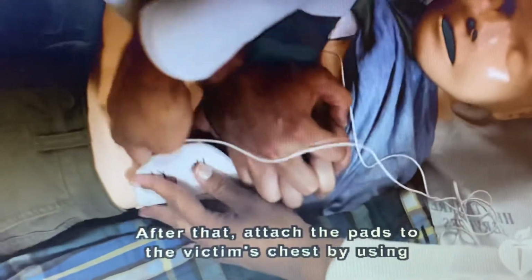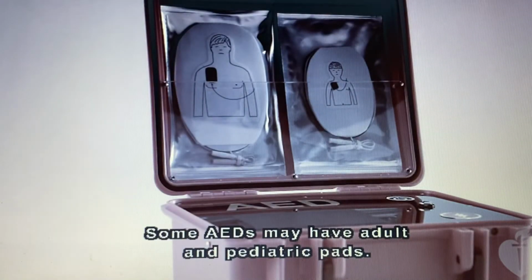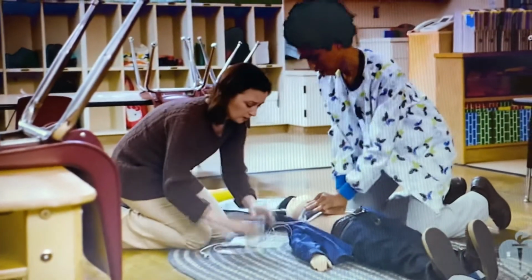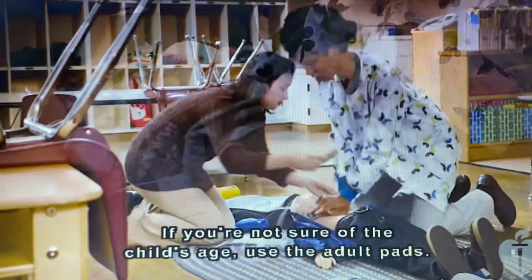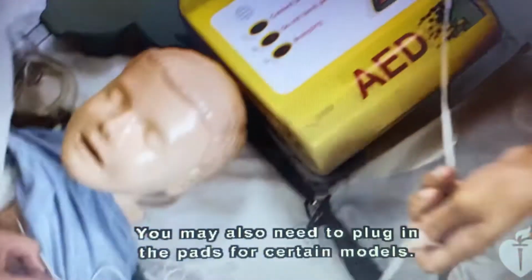After that, attach the pads to the victim's chest by using the diagrams on the pads for correct placement. Some AEDs may have adult and pediatric pads. Be sure to use the adult pads on anyone 8 years of age or older. If you're not sure of the child's age, use the adult pads. You may also need to plug in the pads for certain models.